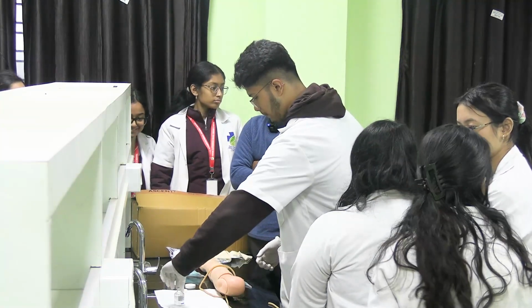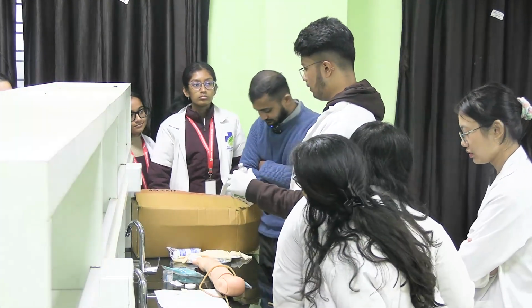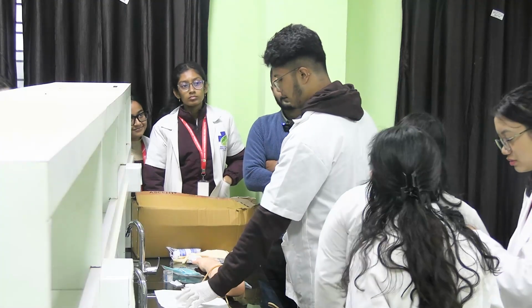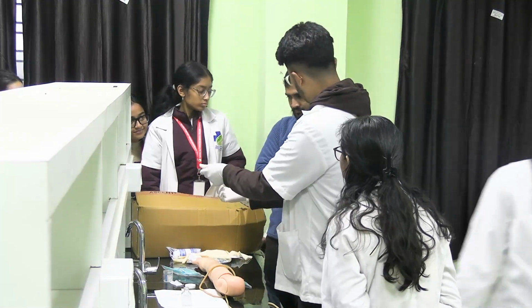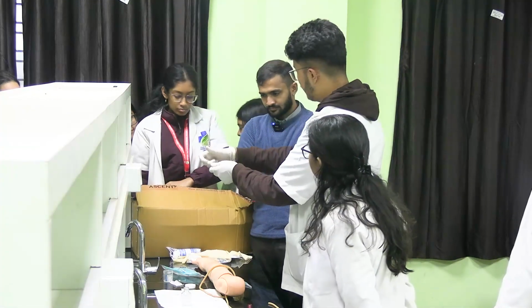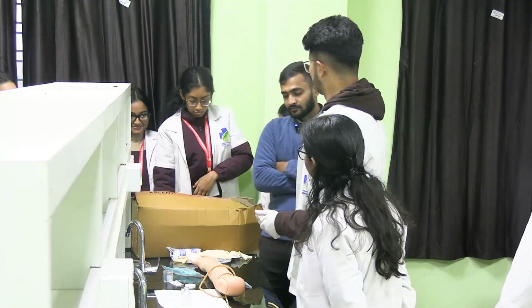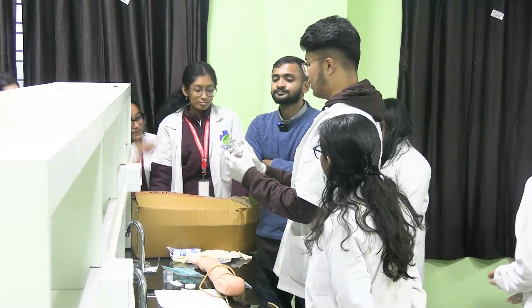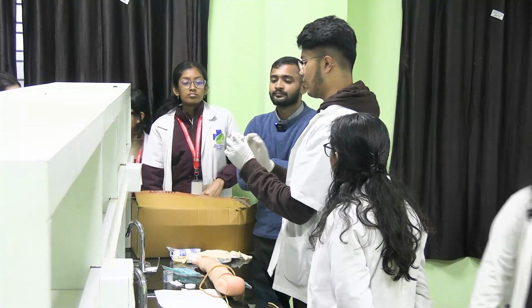Okay. Then after this, sir, take the medicine. I'll first check the label. If it is from the ampule, then sir, I'll take the ampule, use a gauze, and hold the ampule with my non-dominant hand. Then with the gauze, I'll touch the neck of the ampule and break it. In case of vial? I'll take the vial, check the label, the dose, the manufacturing date, expiry date, as well as the color, sir.